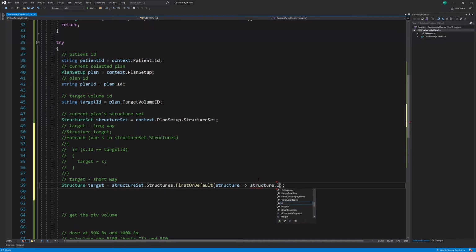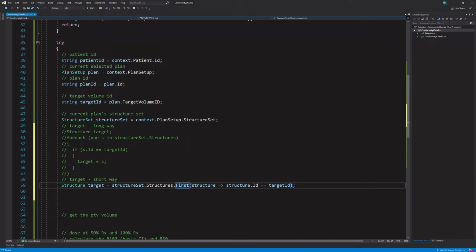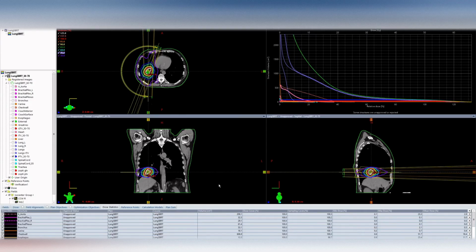So structure.id equals target. What do we call it? Target ID. Okay, so this would be the short way, right? What it's going to do is, the first match that it finds, it's going to select that. Now, the reason that this says first or default is, we know that there's a target volume ID, right? Now, there's not always one, but we know that we've selected one.